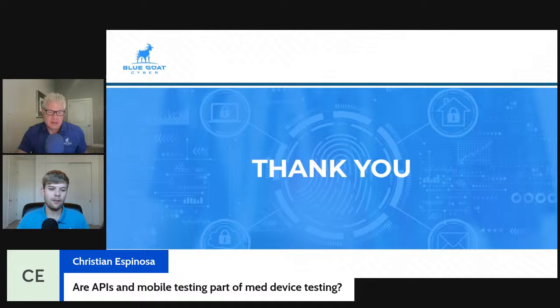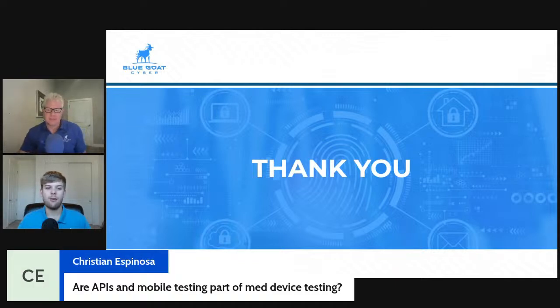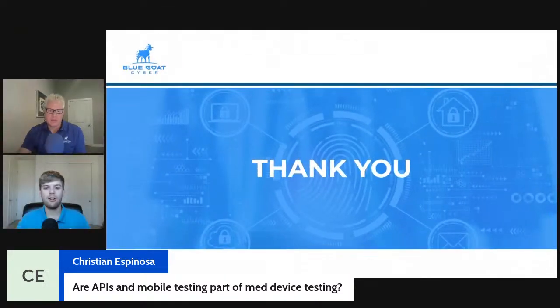We have another one here. Are APIs and mobile testing part of med device testing? In many cases, yes. APIs in software as a medical device are super common, even with physical devices. Often there will be APIs calling to an update server or to an installation server. And for mobile testing, a lot of medical devices come with an accessory app, or some medical devices are only an app for your phone. So both of them are super common. We see them all the time. And they follow similar strategies and approaches to web application testing, of course, just targeting a little bit of a different interface.